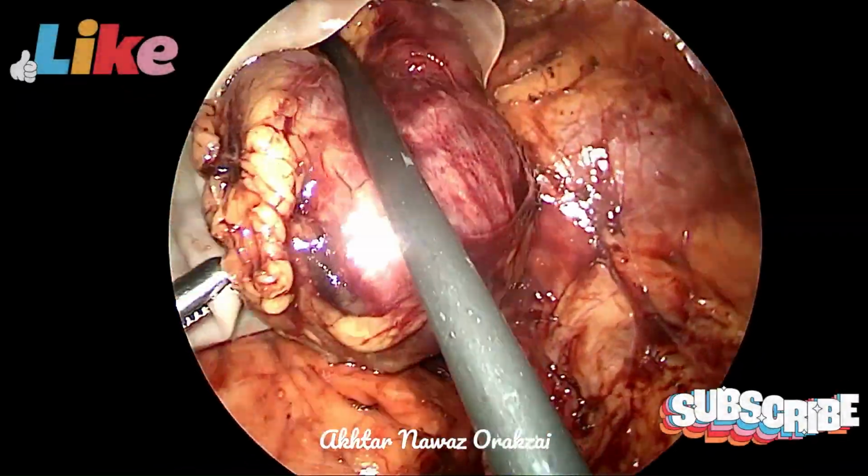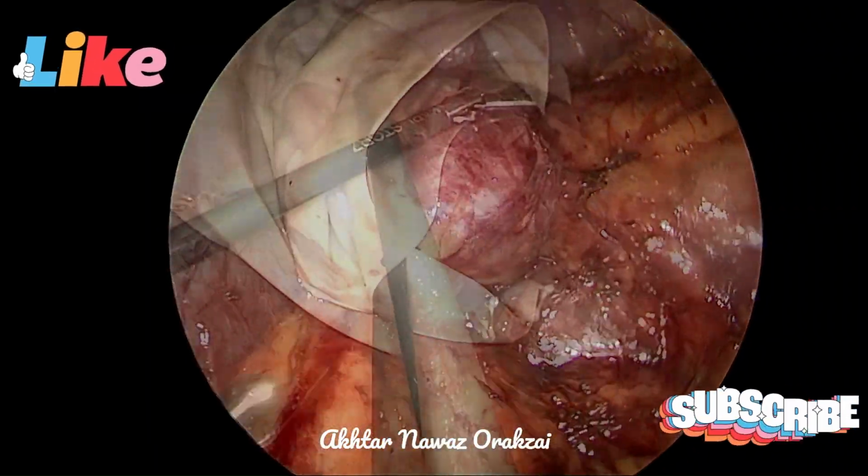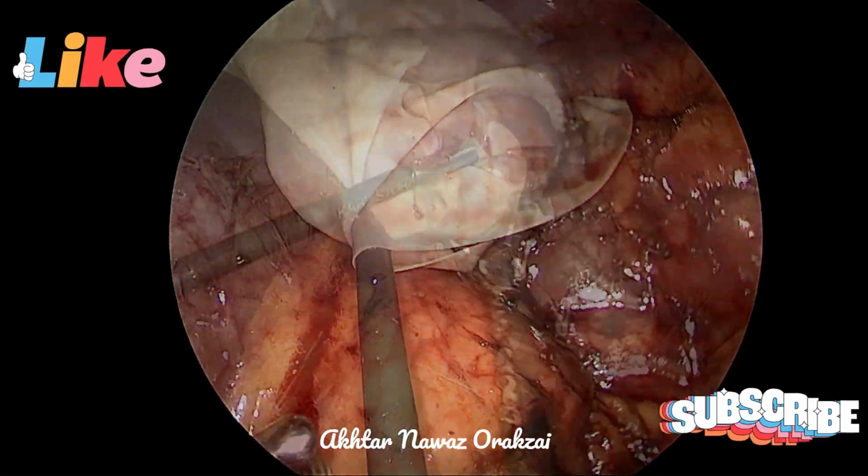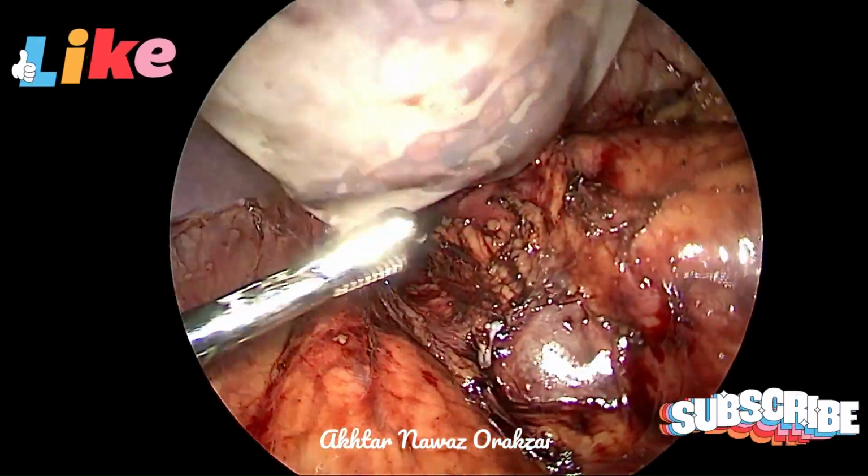specimen into a glove bag, and then we remove it through the visual port side.